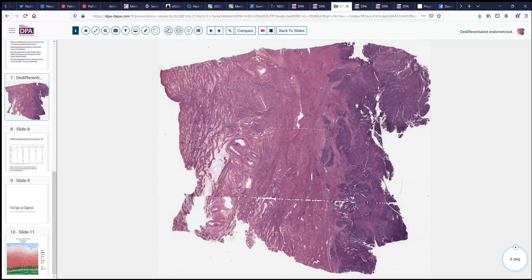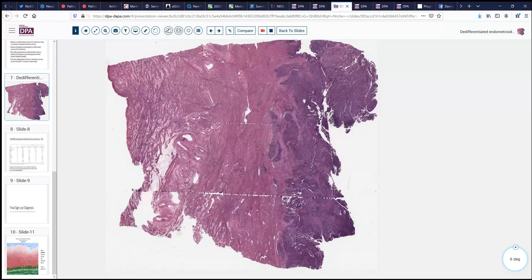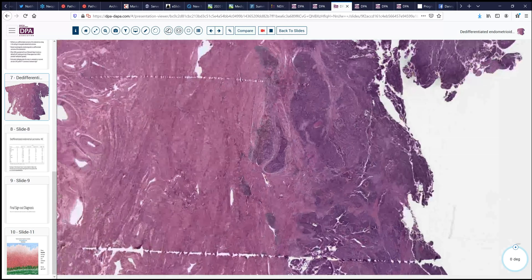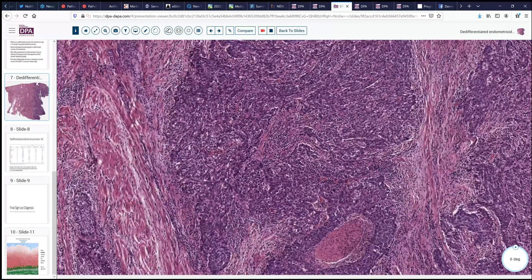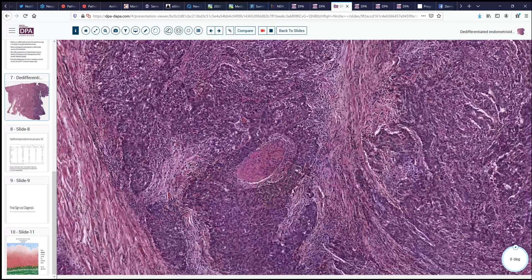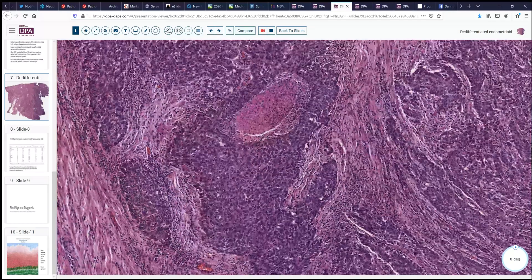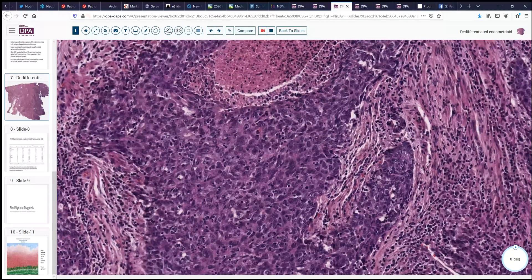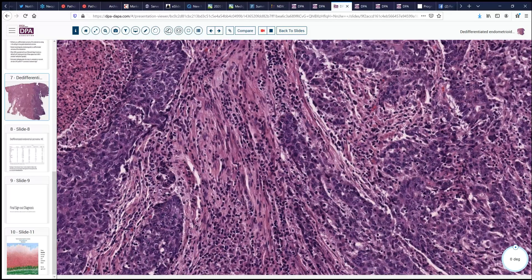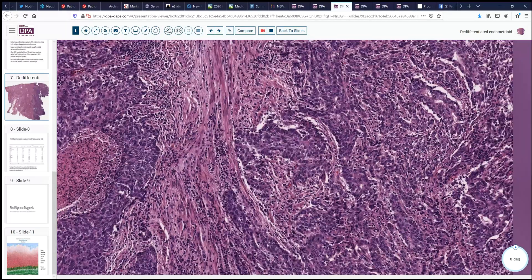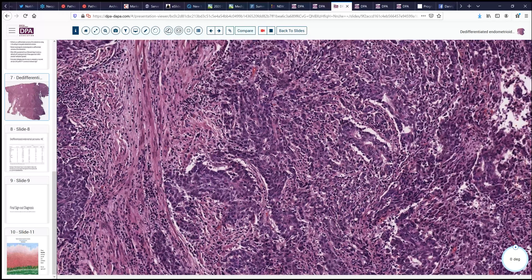Looking at an example of a pure undifferentiated tumor, we see a very blue tumor with invasion of the myometrium, not very deep. At higher magnification, it has a little bit of epithelial orientation, but there's no gland formation per se, and there are areas of necrosis. These tumor cells are very high grade, very blue, high nuclear-to-cytoplasmic ratio, high mitotic rates, with very minimal differentiation of glandular or structural form. They are oftentimes associated with a fairly dense lymphoid inflammatory infiltrate, perhaps reminiscent of medullary-type carcinomas of the breast or colon.